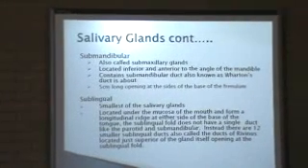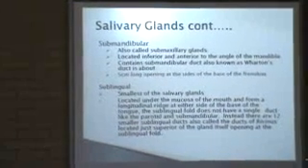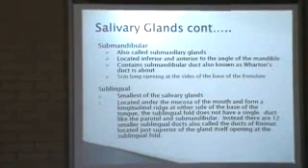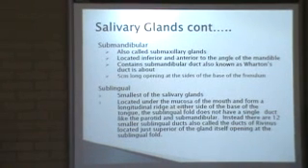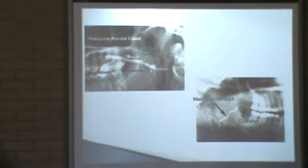And it doesn't have a single duct like the parotid or the submandibular. Instead, there are 12 smaller ducts, basically go from the gland straight up, and that's where we get the heavy fluid buildup that goes underneath our mouth when we're feeding our food or smell something cooking in the kitchen. Here's a couple of examples, radiographs.